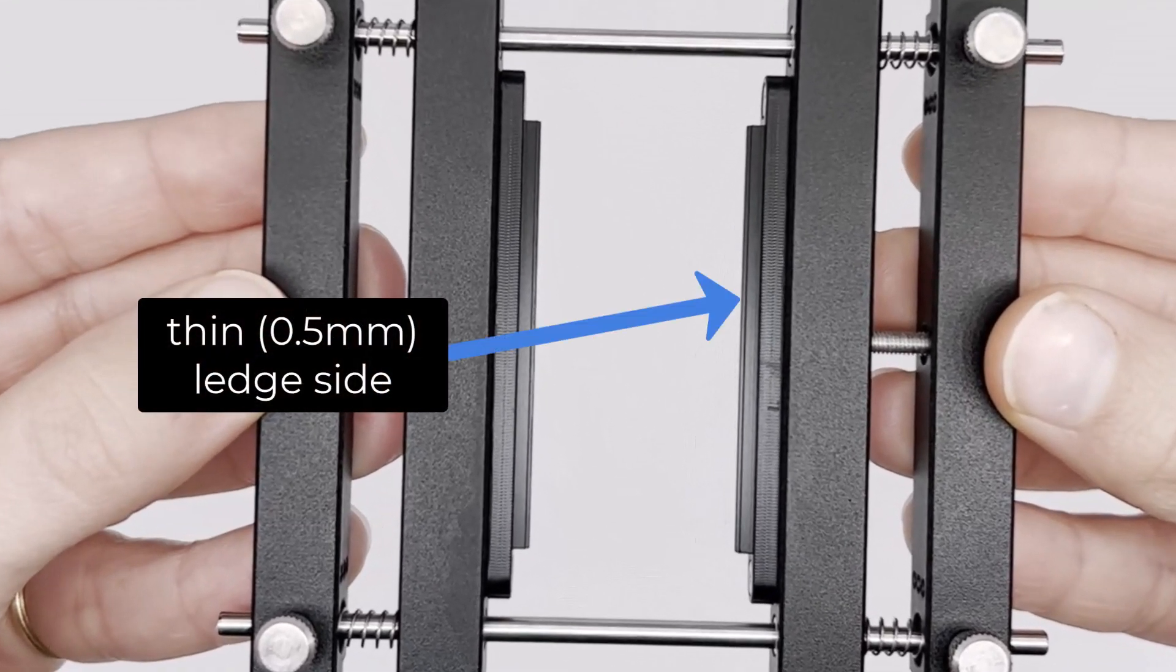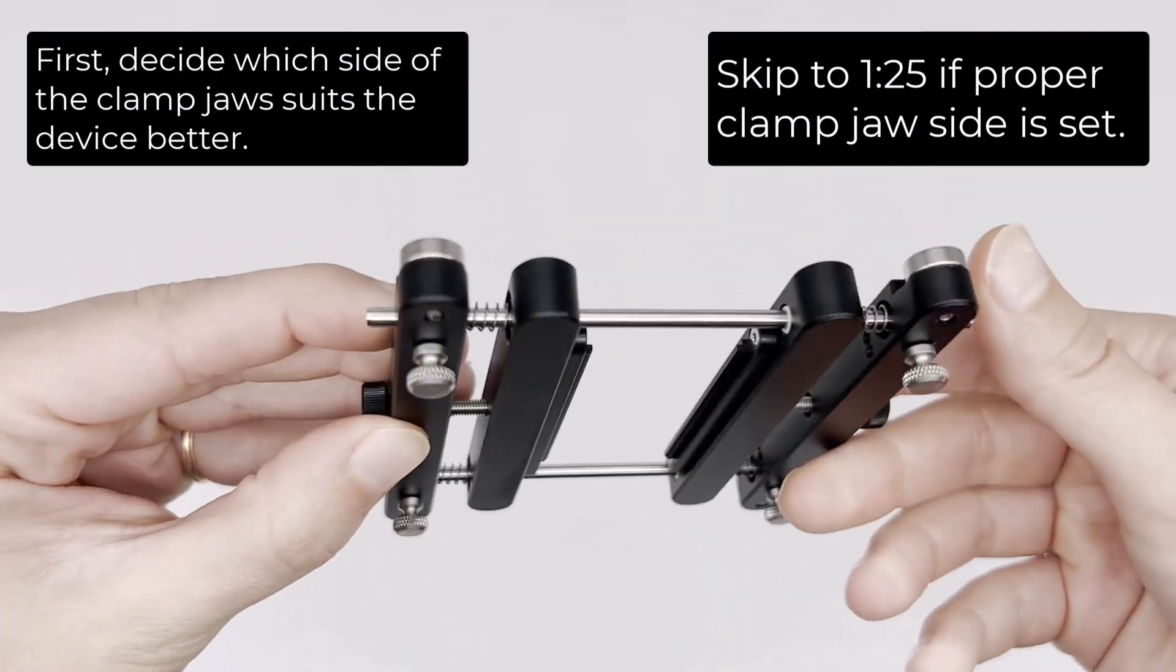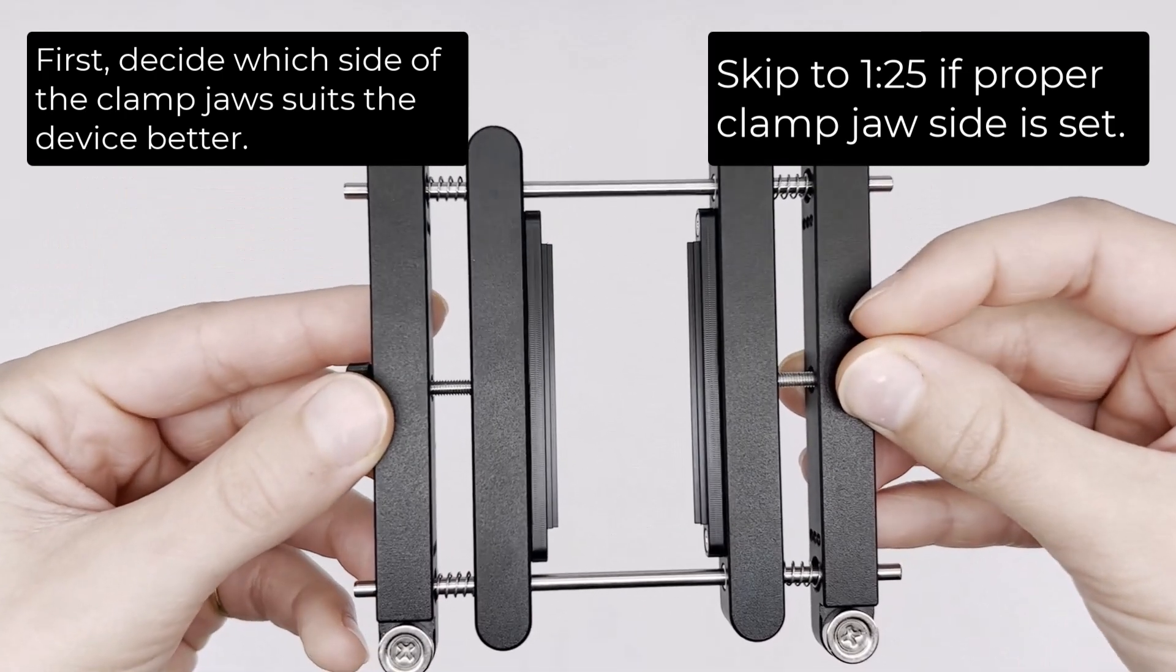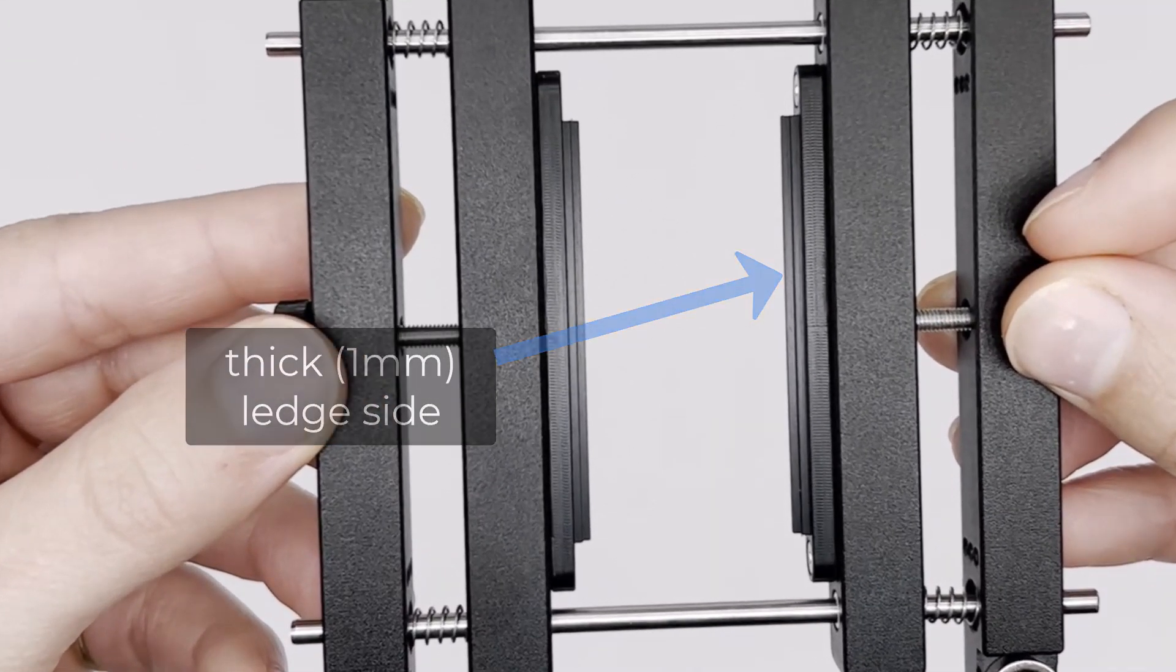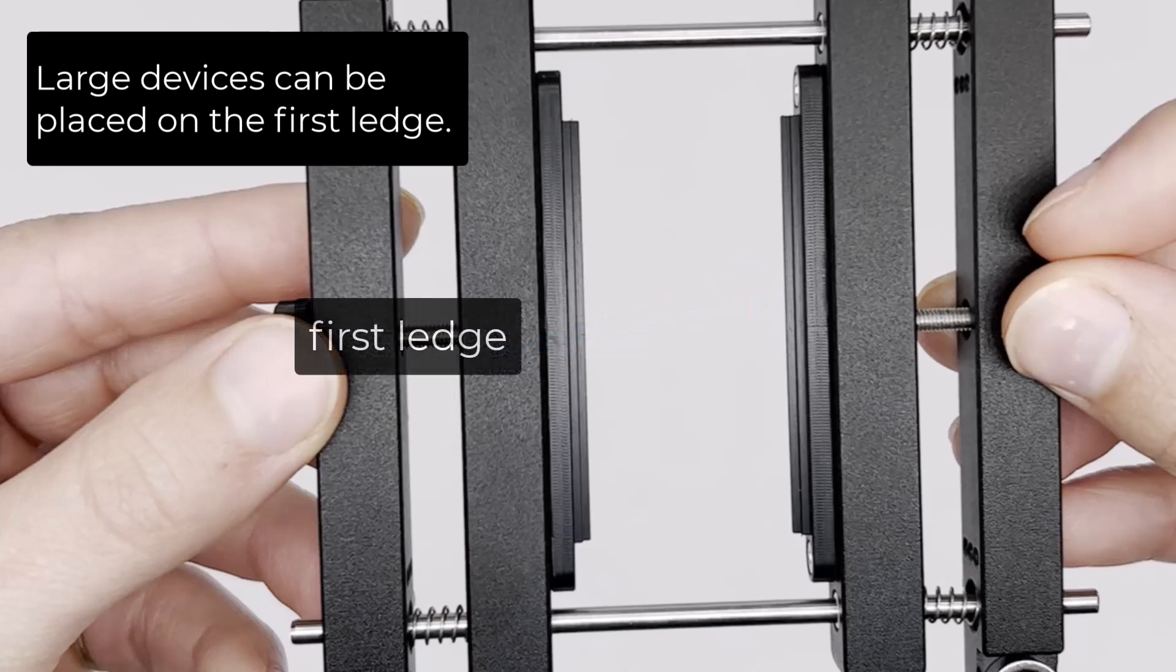The thin side has half millimeter ledges. The thick side has one millimeter ledges. Large devices can be placed on the first ledge.